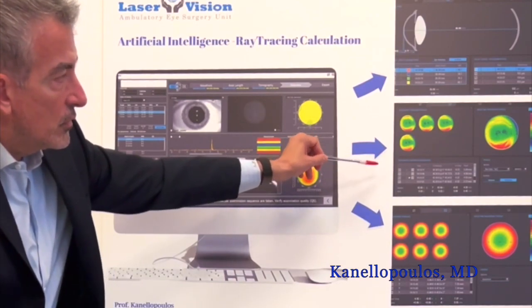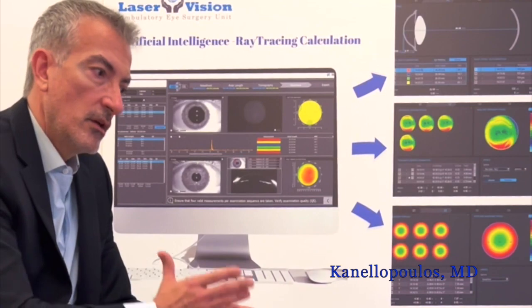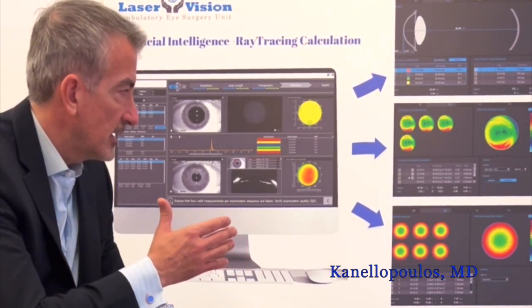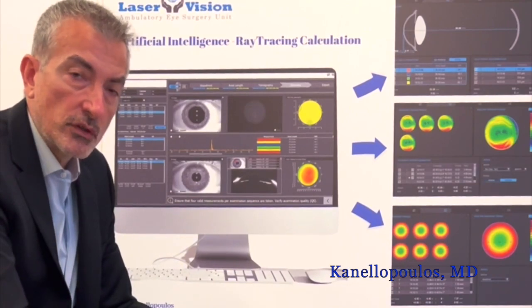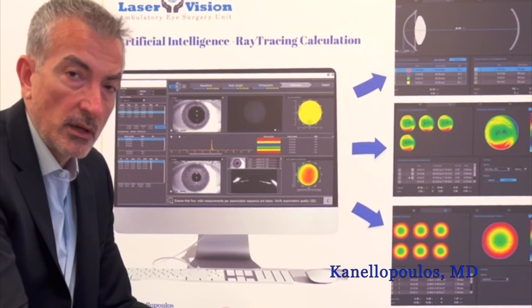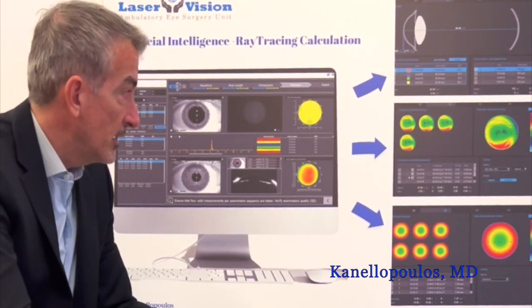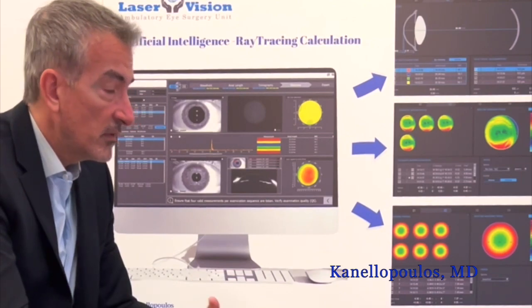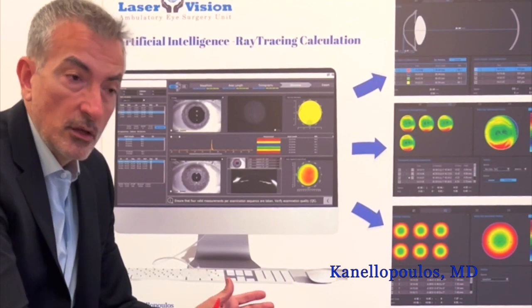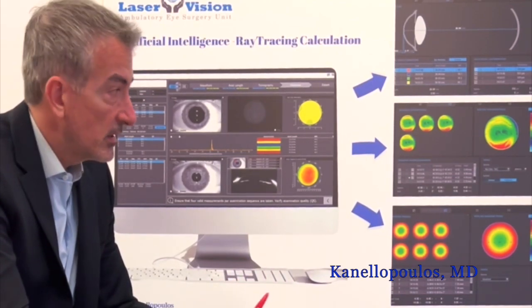Pentacam maps are used to study 2,000 rays from the Pentacam device traveling through air, incident on the anterior surface of the cornea, through the cornea, coming out from the backside of the cornea into the aqueous, the anterior chamber cavity, and then reaching the front part of the crystalline lens. And that's the 2,000 rays of ray tracing towards the eye.